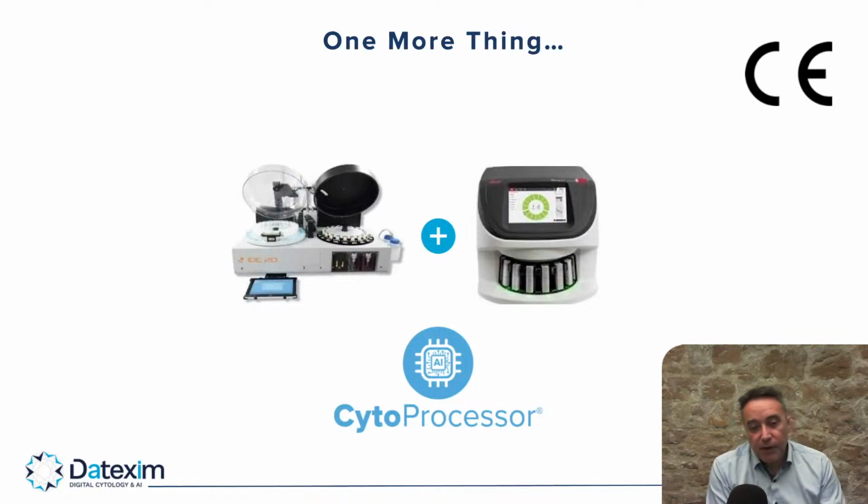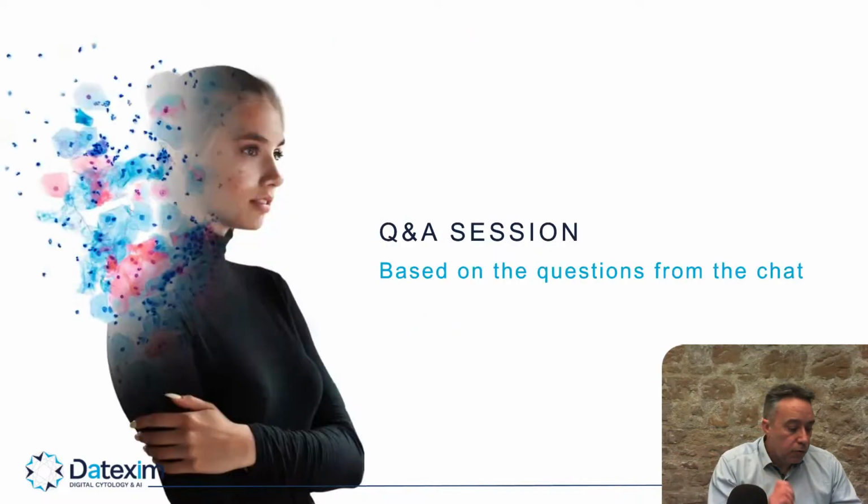One more thing I wanted to tell you about is we also finalized an adaptation to the Leica GT450DX for the IDC20 machine. So not yet using slides, but for this preparation from the French company Diagnostics, because it's a real monolayer and we can use only one focal plane image. I'm checking if I have other questions now.